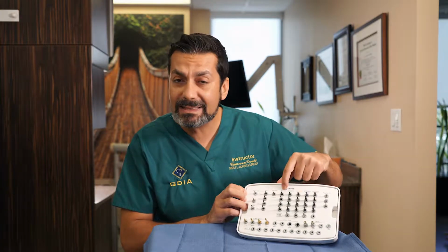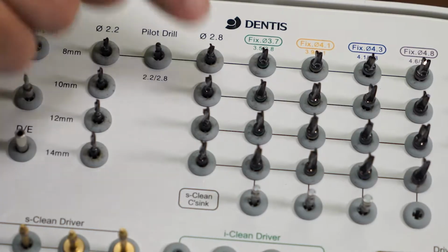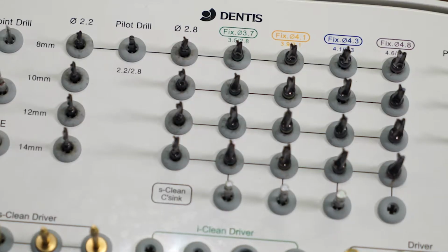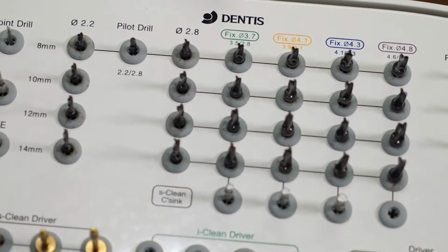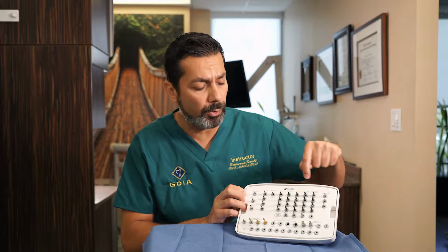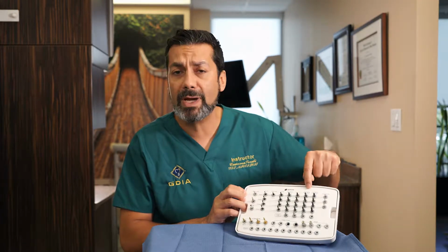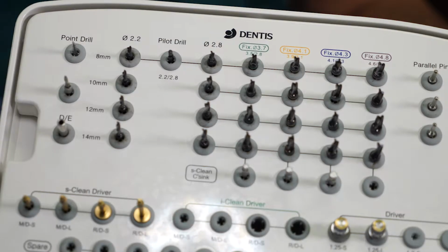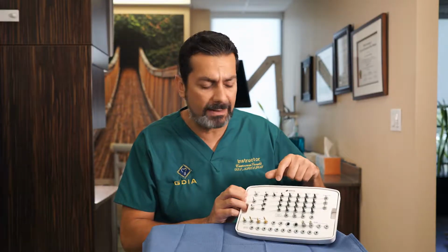The 2.8, which is your next sequence of drill, also comes in 8, 10, 12, and 14 millimeters. Then we get to a 3.7. Now if you notice, starting at 3.7, they are colorized. So you have a green, a yellow, a blue, and a purple. That means that in these sizes you actually have implants. So prior to your 3.7, basically your 2.8 and 2.2 are just preparation drills. There are no implants in that size.